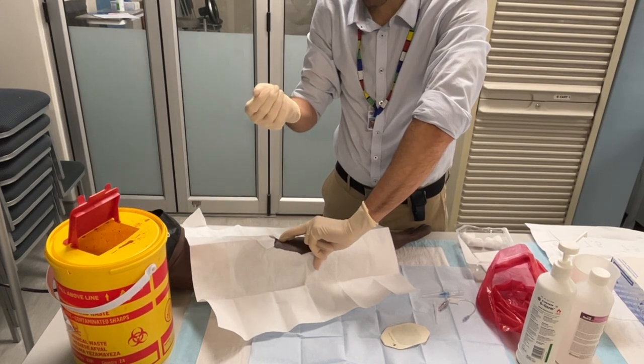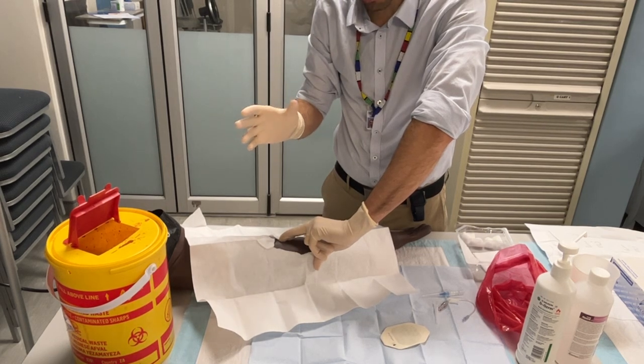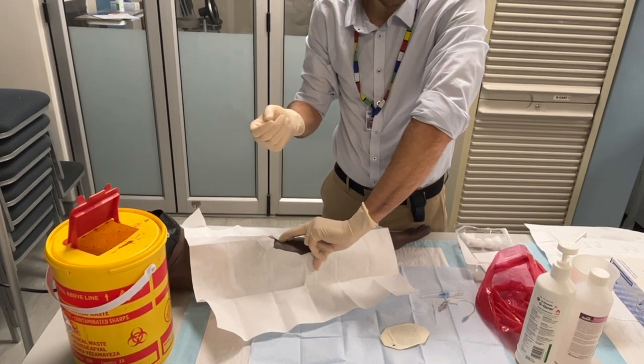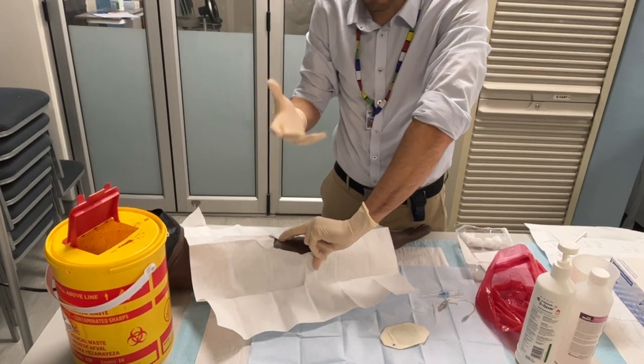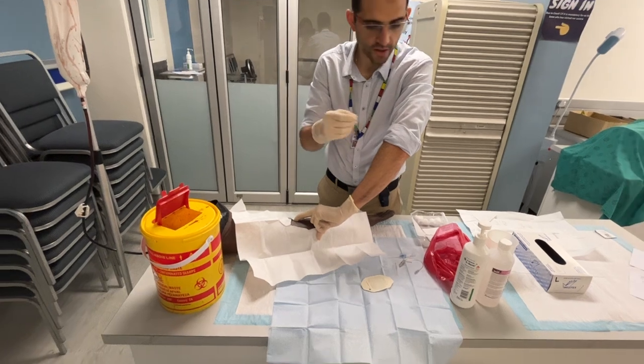It's very important when you're doing the procedure that you're concentrating on the procedure, because especially in a resus situation where there's a lot of people around, you don't want to turn and prick your colleague. So do keep that in mind.